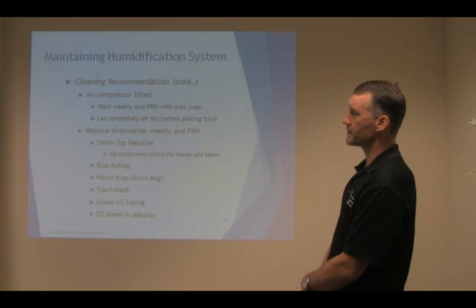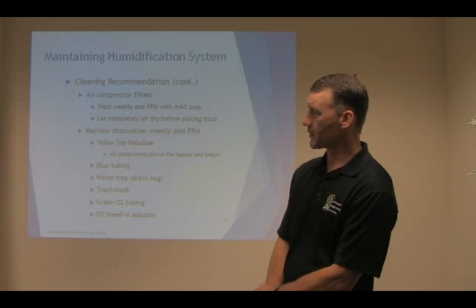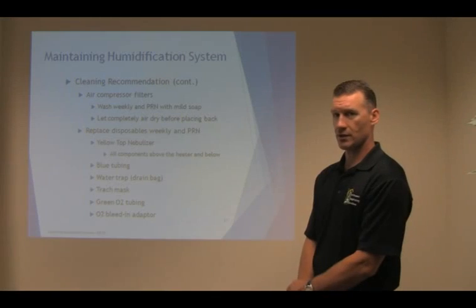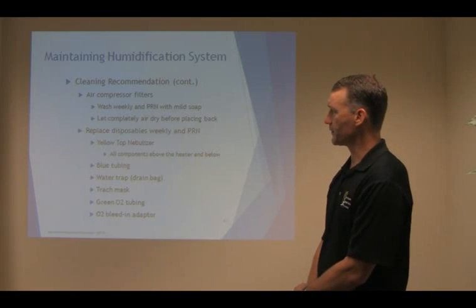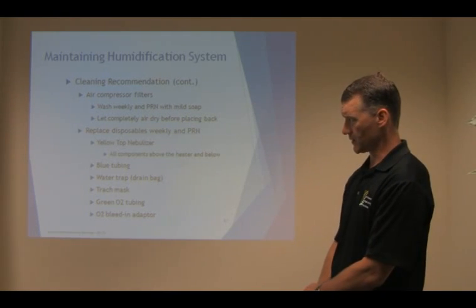Air compressor filters. As with concentrator filters, if this is in a long-term care facility, we want to make sure we wash them weekly, and as needed with mild soap. Let them completely air dry before placing back. It won't hurt the machine to run for short periods of time without those filters in, but it's of utmost importance that we wash those filters out, otherwise the machine can overheat.